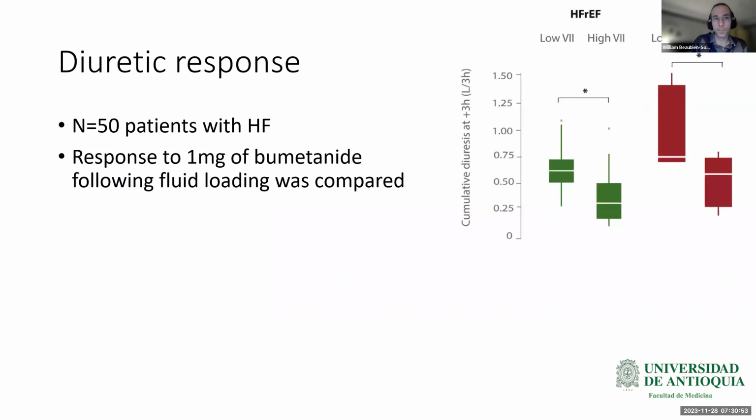Lastly, the appearance of these abnormal venous Doppler signs might tell us other things about treatment response. One of the most interesting components is diuretic response. There have been some animal studies and some human studies that have previously shown that with an increase in kidney congestion, people respond less to diuretic treatment.